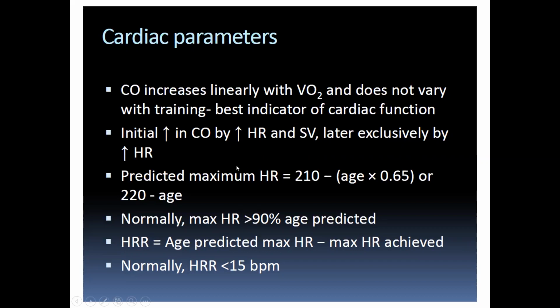Imad, is it important to know where you meet anaerobic threshold to calculate the slope of VE to VCO2? Yes, because the VE to VCO2 slope can be measured in different ways. Most of the prognostic studies of VE to VCO2 measured the slope at anaerobic threshold, whereas other people contest that and say you should measure the VE to VCO2 slope using the entire data points all the way to peak VO2 and average out to come up with an average number.